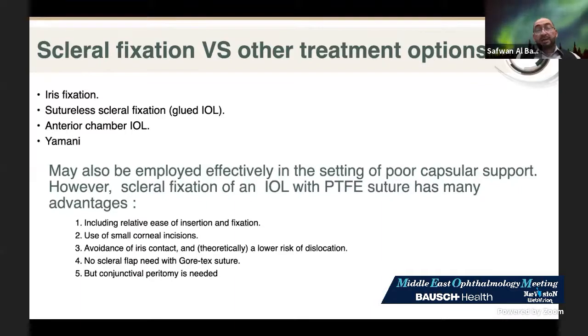It also avoids iris contact and theoretically carries a lower risk of dislocation and pigment dispersion glaucoma. No scleral flap is needed with the Gore-Tex suture, but a conjunctival peritomy is needed, in contrast to Yamani, where we don't need any conjunctival peritomy.